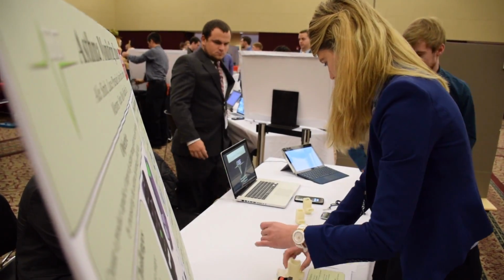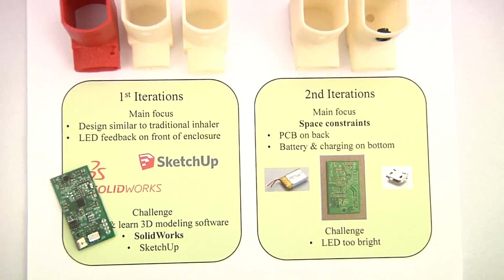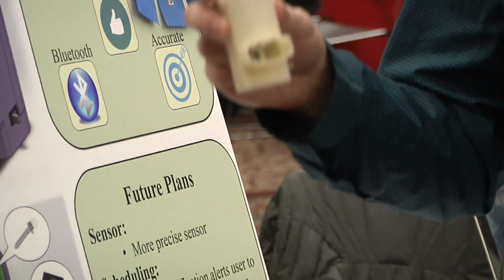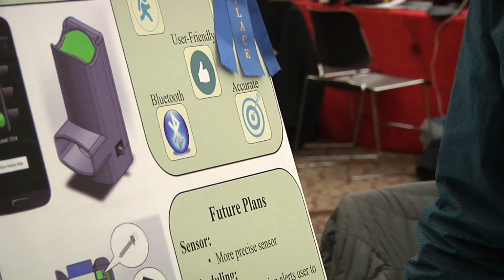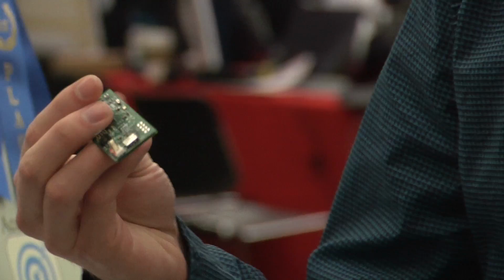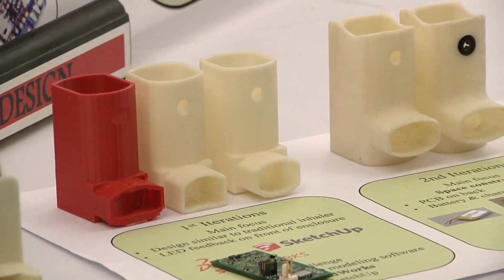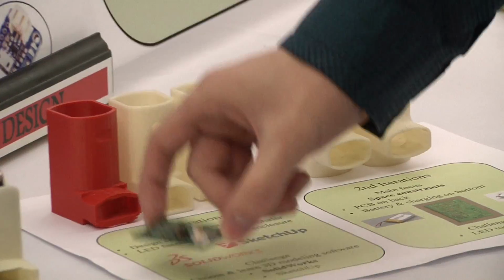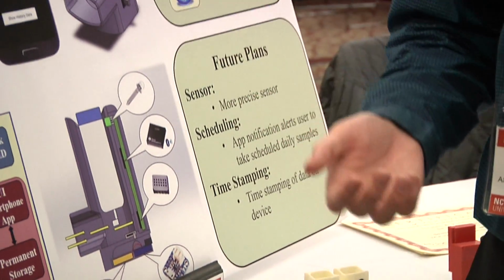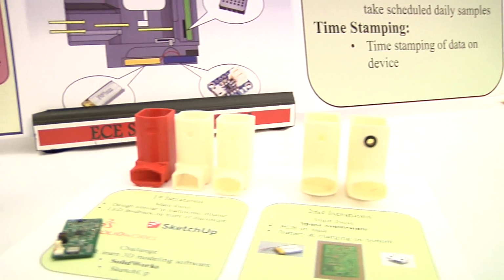So our hardest challenge in this project was how small we had to get the inhaler. We wanted it to stay as close to a traditional inhaler as possible to make it a seamless experience for the user. However, the problem with this was that we then had to compress all this functionality into a very, very small board. And this provided difficulty both with power, because we couldn't use a big battery for a longer lifespan, as well as just what sensors we could put on the board. We had to go with one sensor because we simply didn't have enough space to put anything else on the board. So getting that concentration reading from one sensor proved difficult.